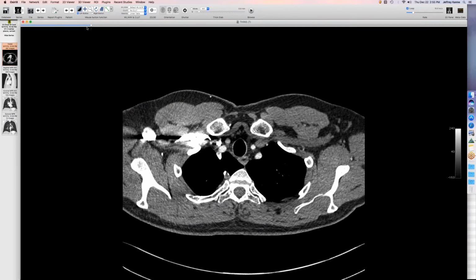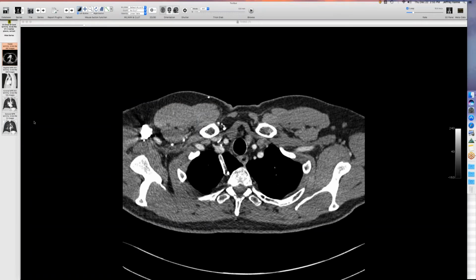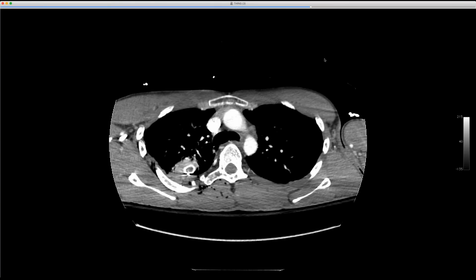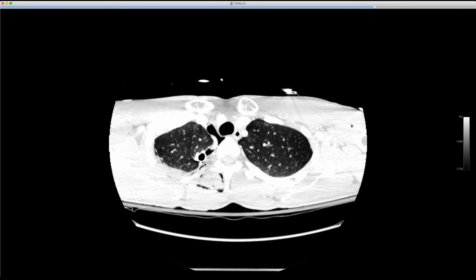So Jeff, was that a trauma case or was that a surgery case? That was this last trauma case. I'll bring up the previous again, and let's see when that azygos goes adjacent. There's pneumothorax, isn't there? And where's it going actually? So I was intrigued. Yeah, so it pops up actually. Here's the pneumothorax.